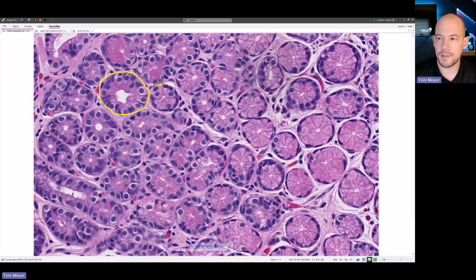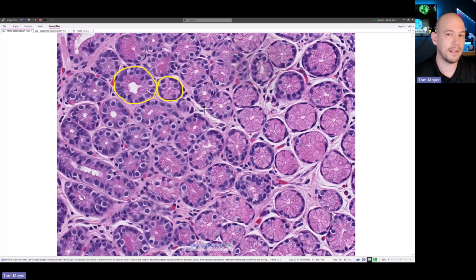And you can see I can just continue on through this image. I'm highlighting glands within this tissue section. Again, depending on the amount of labels I need to add, this could take a few seconds if I have a single object, up to several minutes or hours, and that's compounded by the number of images where I need to manually outline objects.